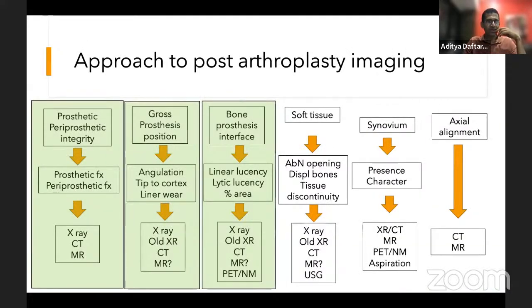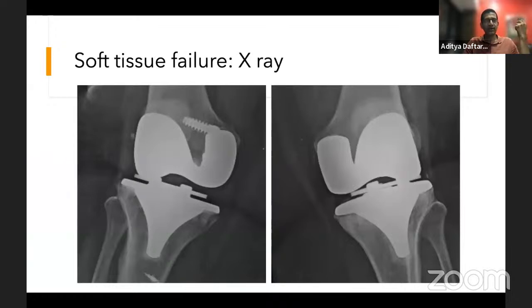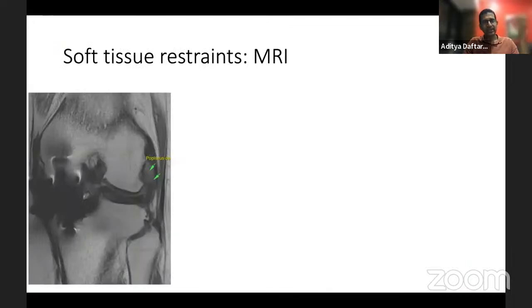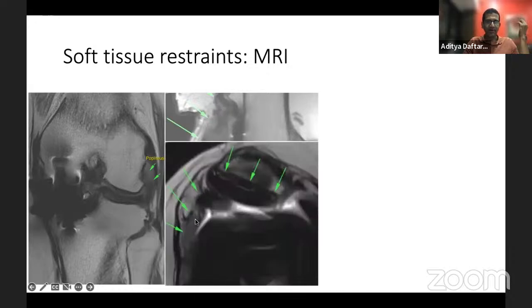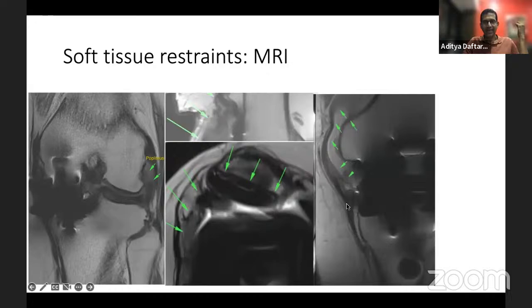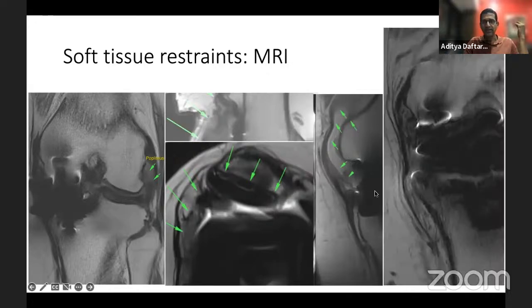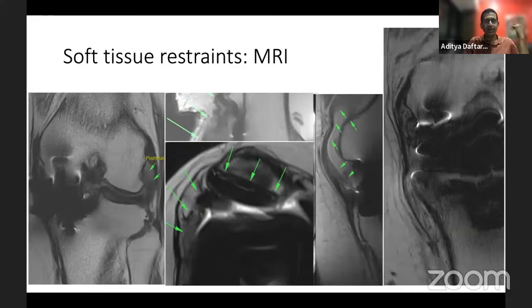We now move to soft tissue restraints. On radiographs, we look for soft tissue failure via joint space widening or patellar dislocation. MRI is fantastic for soft tissues. Examples include popliteus tendon avulsion in a unicompartmental arthroplasty, clear quadriceps mechanism rupture, patellofemoral ligament and retinaculum tearing with abnormal patellar tilt and position, MCL coming off from its femoral attachment, and MCL avulsion from its tibial attachment. We can see all these soft tissue restraints on MRI in multiple planes.